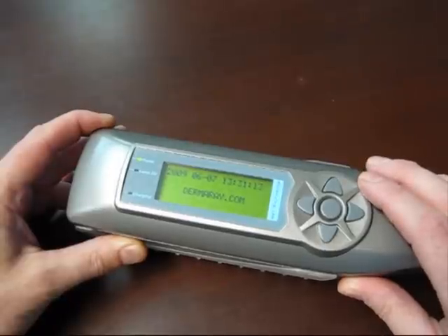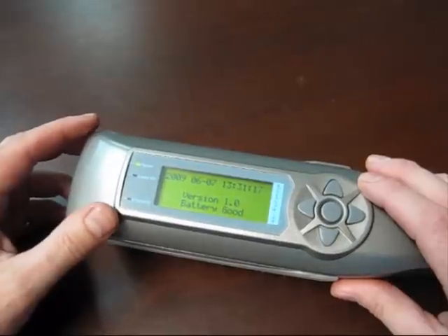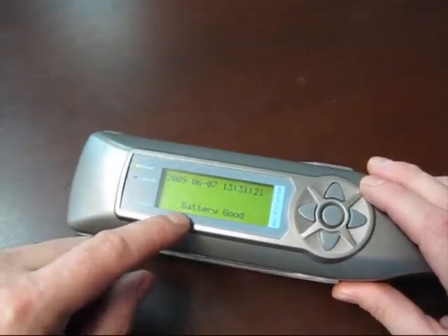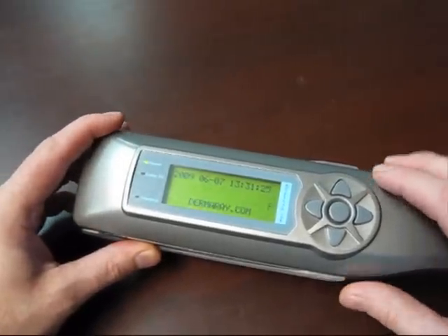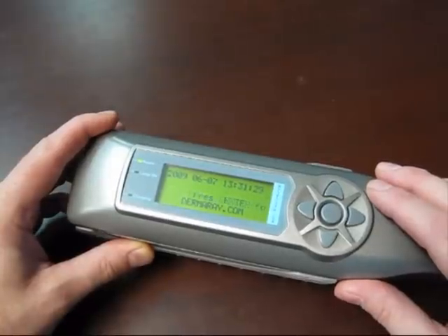Now, because the setup wizard's already been completed, we're at the idle screen. It says dermaray.com, then it'll show the battery status, either full, good, or low, the year, date, and time. Basically, every key has a different function at this welcome or idle screen.